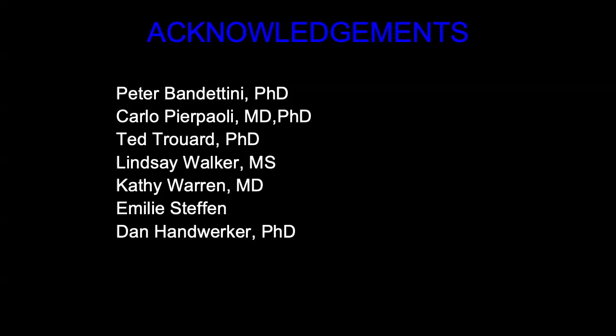I think the disadvantages are more related to the EPI acquisition and the ghosting. You saw the artifact from the fat that I showed you, but regular EPI also has ghosting, the N/2 type of ghost, which maybe someone else had described. That is stronger and harder to get past, so that can be difficult.